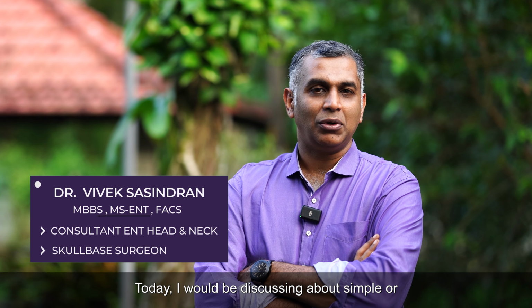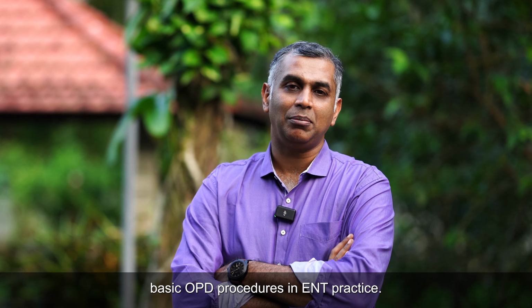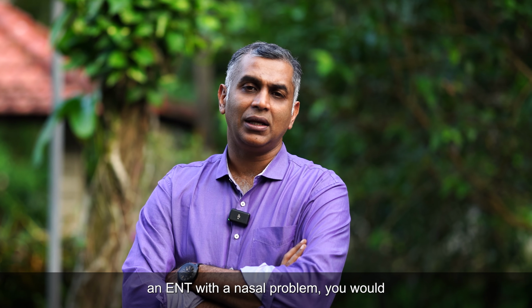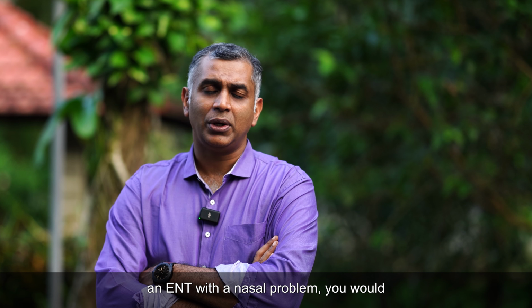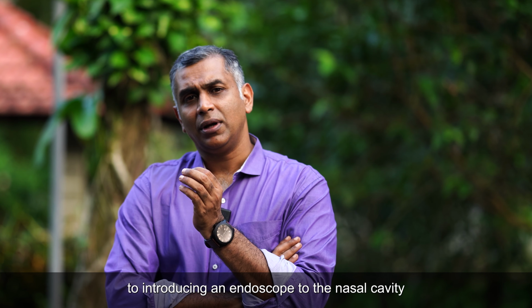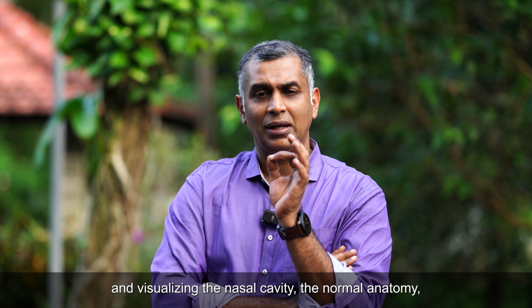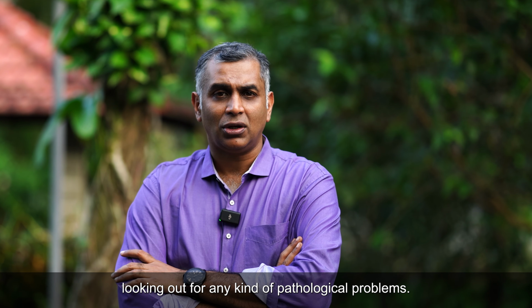Today, I would be discussing simple or basic OPD procedures in ENT practice. Well, for those of you who have consulted an ENT with a nasal problem, you would have been advised a nasal endoscopy. So when we say nasal endoscopy, it refers to introducing an endoscope through the nasal cavity and visualizing the nasal cavity, the normal anatomy, looking out for any kind of pathological problems.